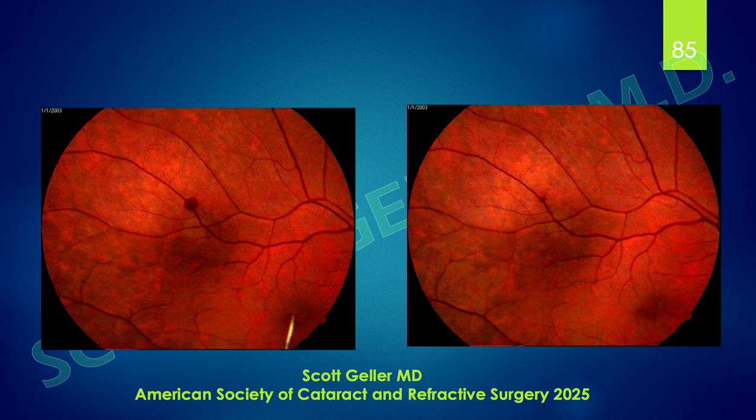So when you're doing a laser in the periphery, don't forget you're not getting, especially with a patient with a normal crystalline lens, in a phakic patient, a completely perfect focal point. So when you don't get a completely perfect focal point, you are getting only a partial optical breakdown.